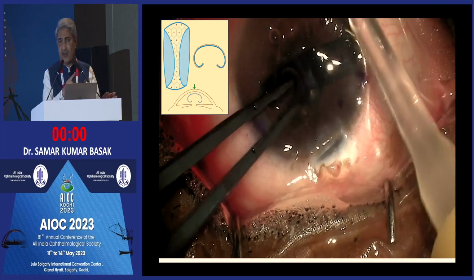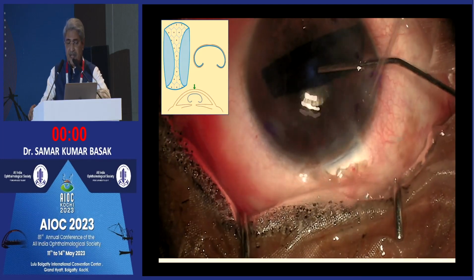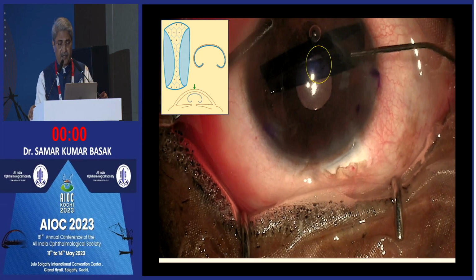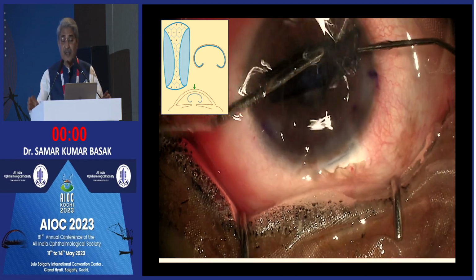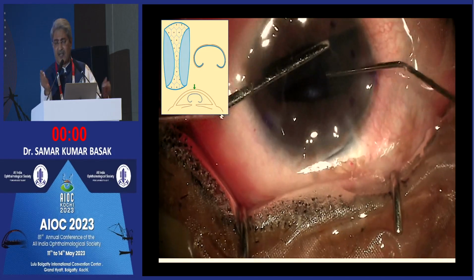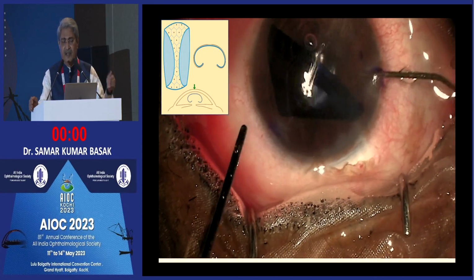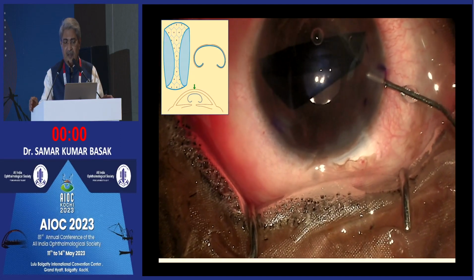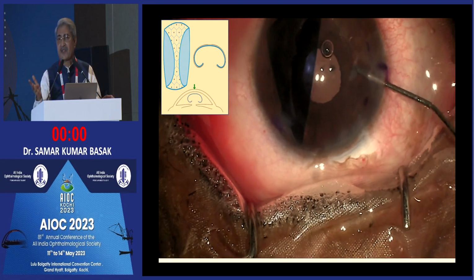What I showed earlier, this is just reverse. Now, when you realize, while you are trying to unfold it, that the S is reverse. I do not know whether you can see it. The S is reverse. So you open it a little, take the graft to the other side, your preferable side, and then you inject in such a way that it flips.